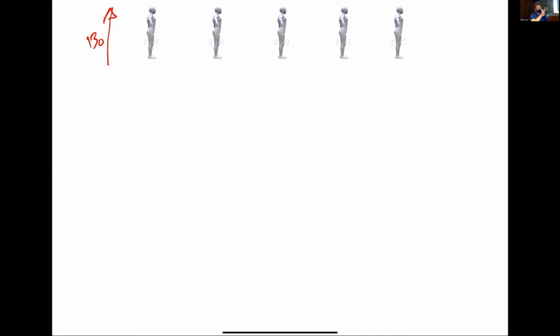Yeah, they should rotate in a clockwise fashion, right? And most people will do that. But sometimes they're not all in sync. They might be rotating at different frequencies. So I say, well, that's not quite correct. Let's say I had a group of people rotating at slightly different rates. How would they correct themselves? What are they trying to achieve? If they're going at different rates, should they stay at different rates or try to go to the same rate? Yeah, so if they're in a uniform field, they all want to go at the same rate.